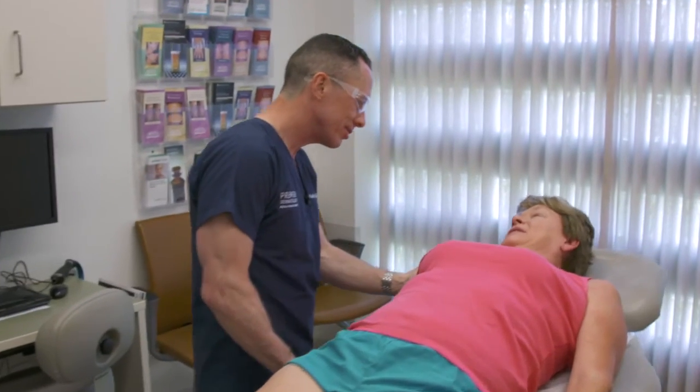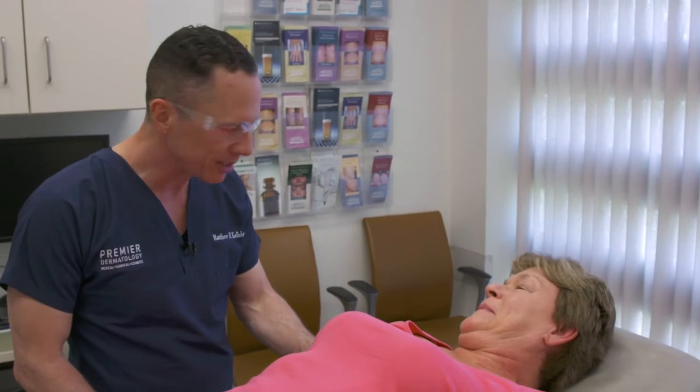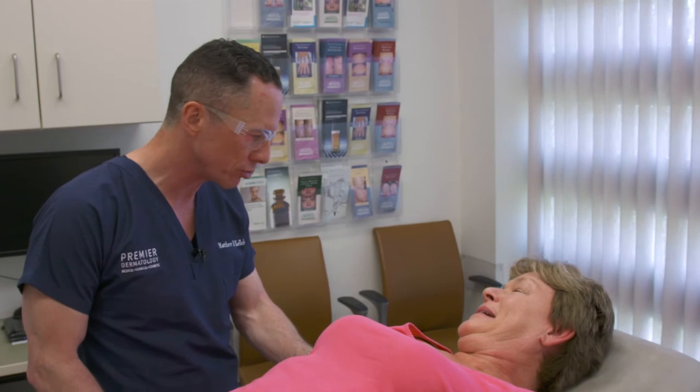How are you feeling? Good. We're all done. You did great — it went perfect. And I expect that these spider veins will be gone, hopefully, from this one treatment.